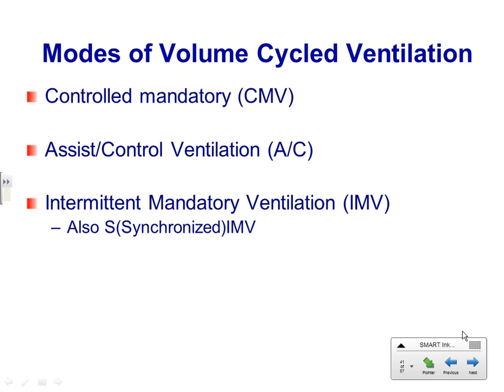So there's no hyperventilation, there's no extra tidal volume that the patient is getting, and you're also able to see on that type of ventilator how many independent spontaneous breaths the patient is taking and how many are being delivered by the ventilator. So what would be the benefit of that?